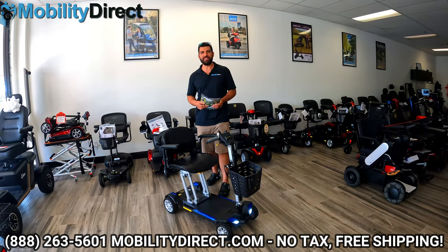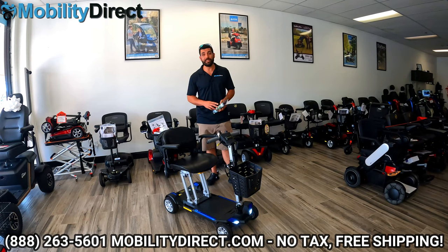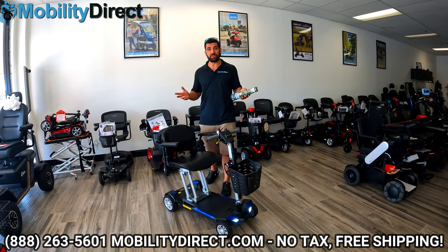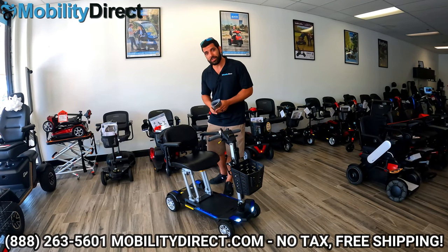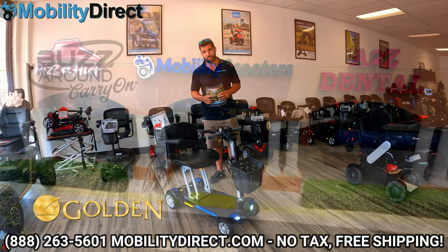Hi everybody, I'm Sergio with Mobility Direct and welcome to our YouTube channel. Thanks for stopping by. In today's video, we're going to give you a review of the top-selling scooter, and that is the Golden Technologies Buzzaround Carry-On Mobility Scooter.